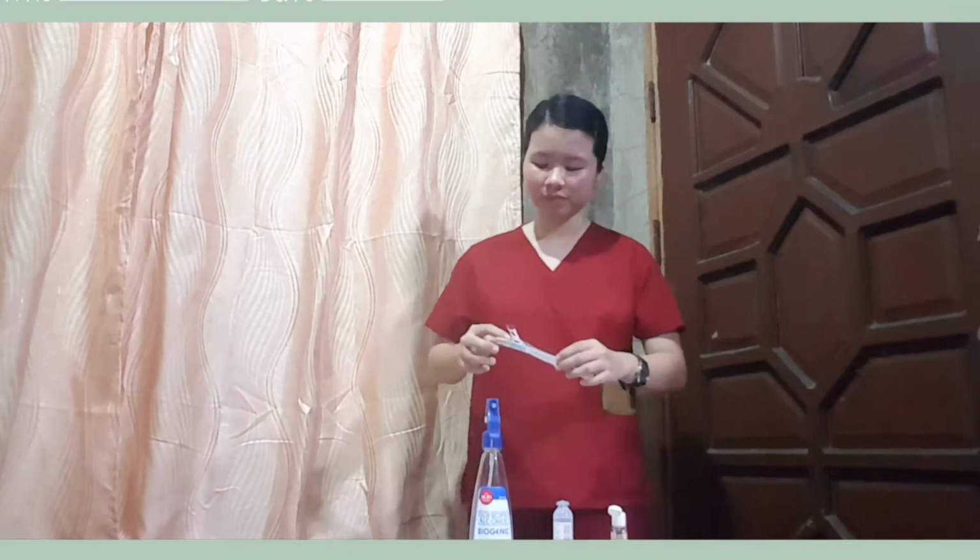And now we're going to proceed to procedure number 12. And now you need to withdraw the ordered amount of regular insulin by tilting the vial upside down. This is to ensure safety and appropriateness of the procedure.